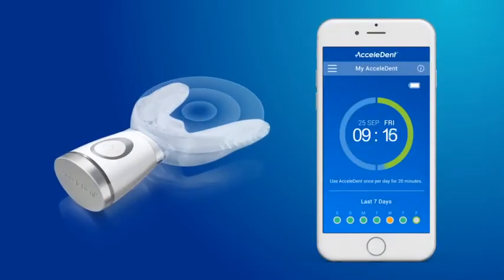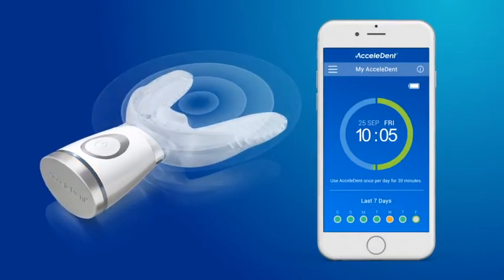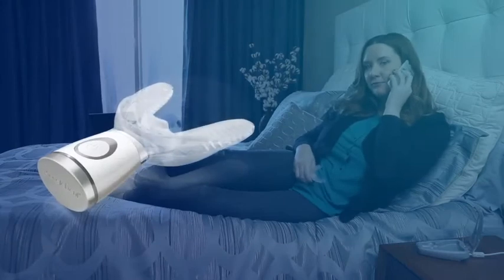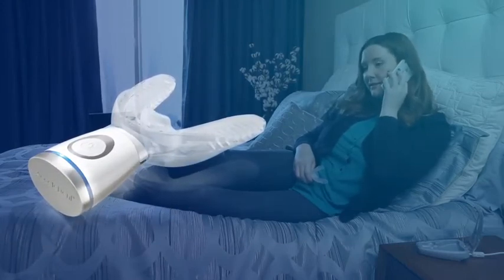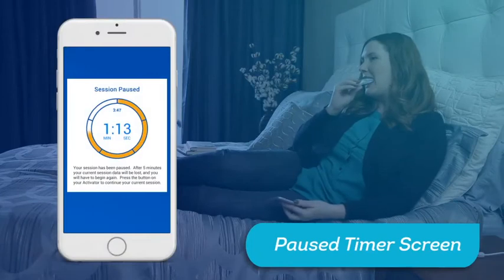Accelident Optima features a half-time indicator which will pulse three times after 10 minutes of treatment. Keep going — you are halfway done. To pause your treatment session for up to five minutes, press the power button once. During the pause, the LED status indicator will pulse blue slowly. When you are ready to resume, press the power button again to continue treatment. A paused timer screen will appear on your app when your session is in pause.